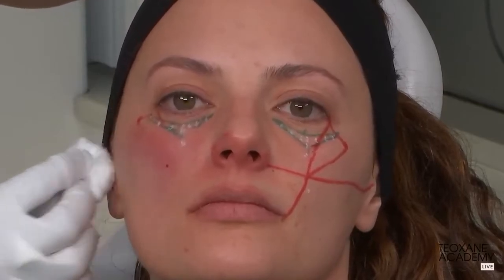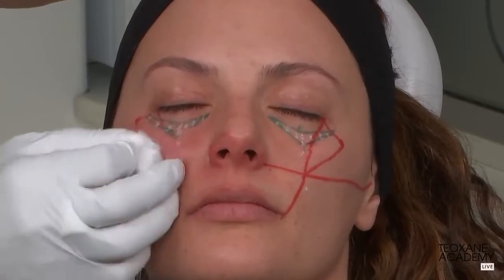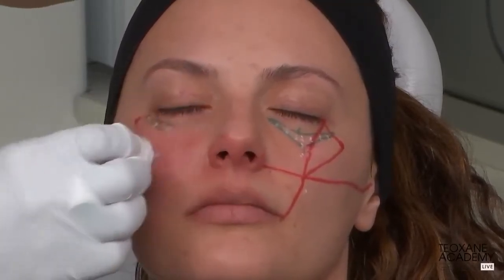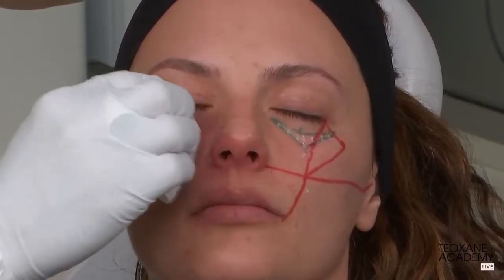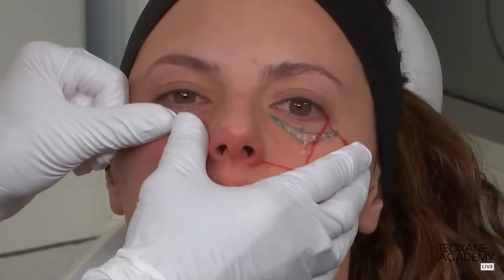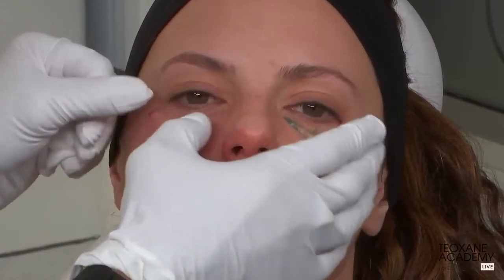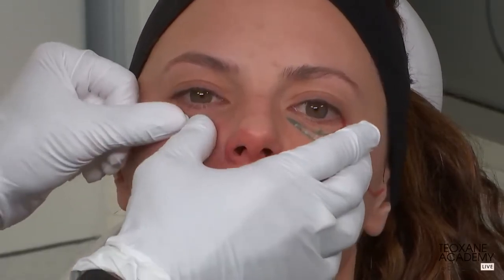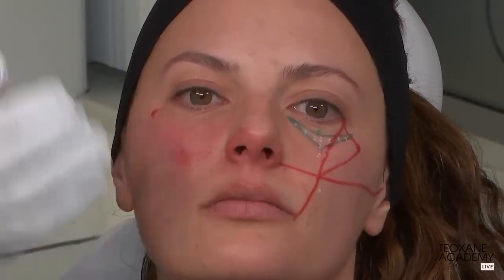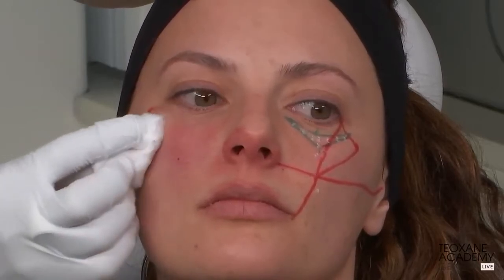So, first of all, I would stop calling it the tear trough. It's more the entire infraorbital area. Treatment is just for the palpebral, the eyelid-cheek junction. So I do some massaging to better distribute the product and to feel if anything is palpable, but I cannot really feel anything. It integrates very well as it is deep under the tissue.